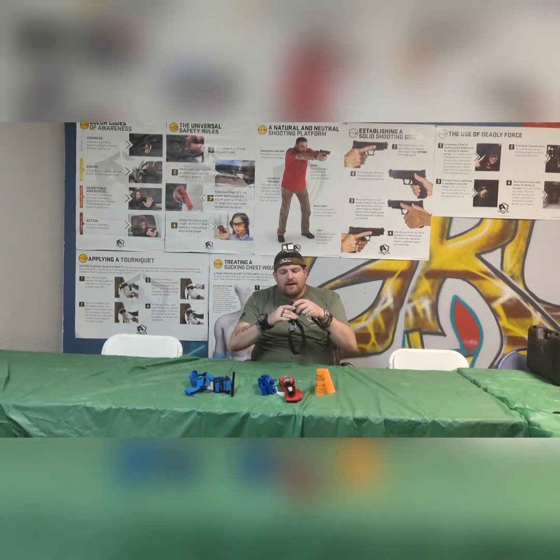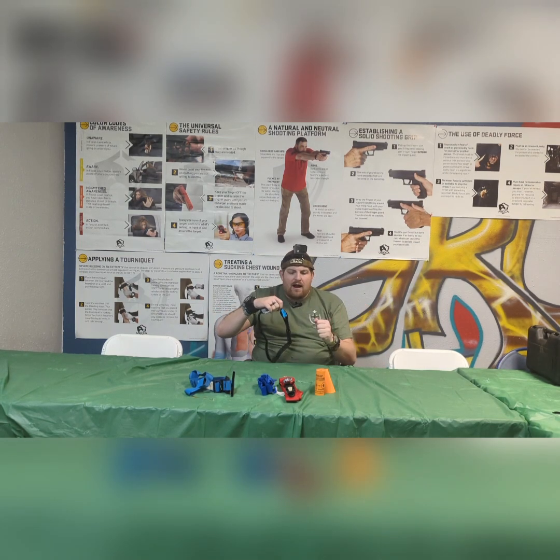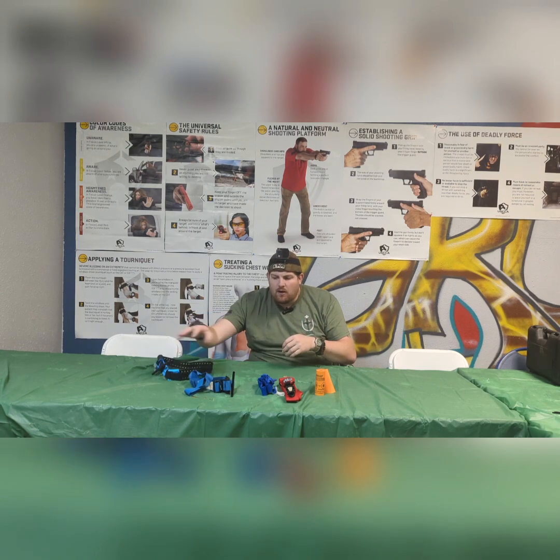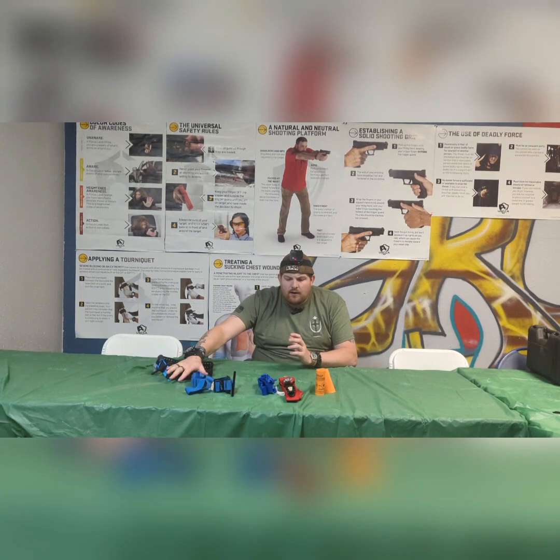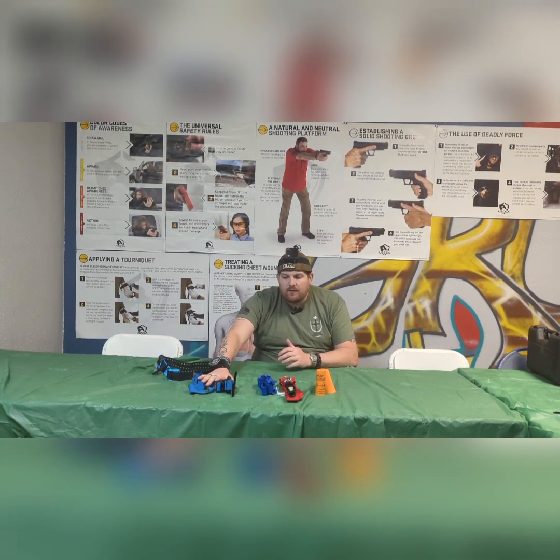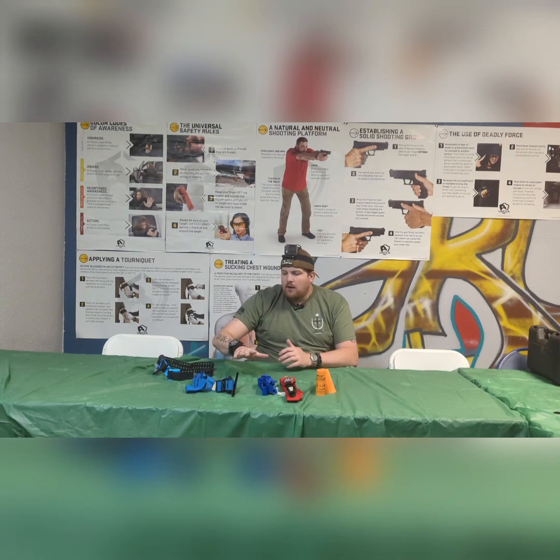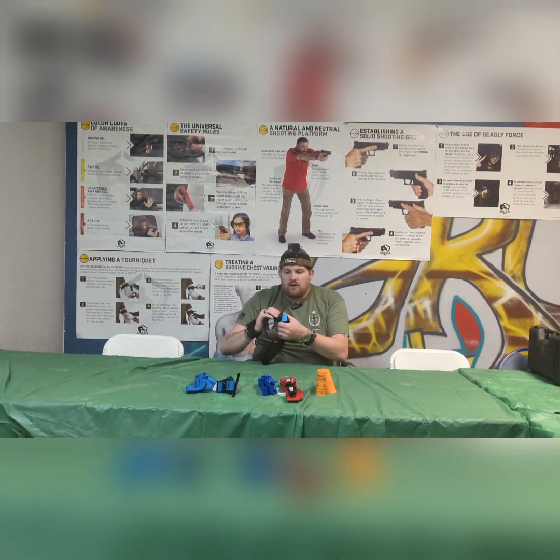So it's a great tourniquet. I love this for self-application and self-aid because I can pull it, I can crack it. I don't have to rely on friction. I have a locking device. I don't have to worry about Velcro failing. I don't have to worry about the friction failing. But for self-application, I would say these two are great options.